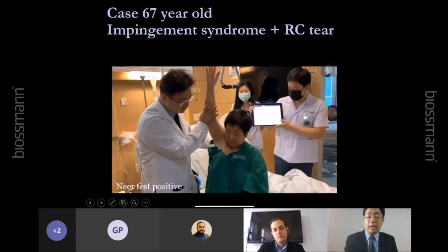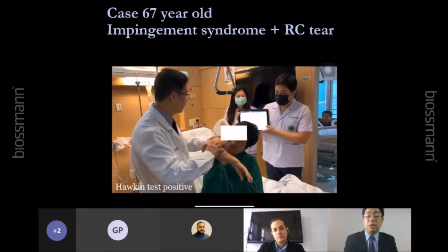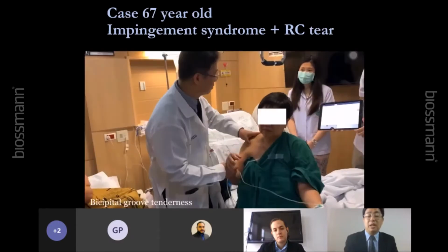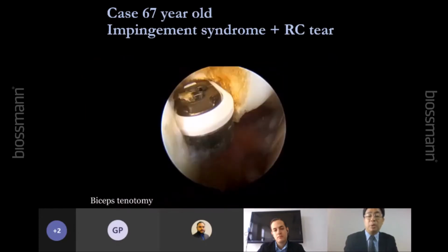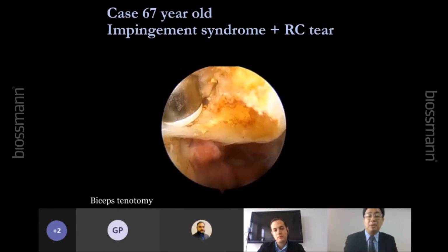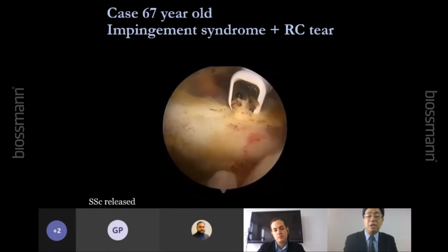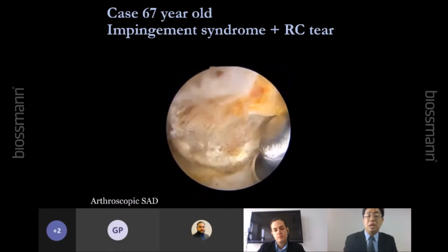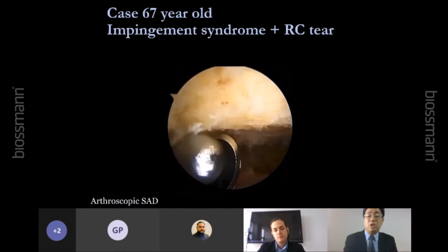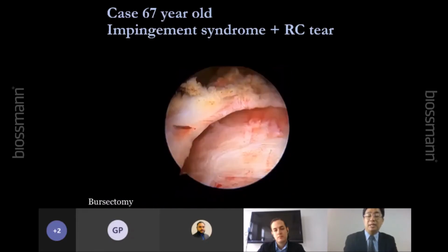So I'll show you one example. This patient is 67 years old, he has impingement and also a rotator cuff tear, okay? He also has an AC joint and biceps problem, right? So when I get in, I cut the biceps, okay? And after that, we do the decompression, okay? This is a spur. We do the subacromial decompression. And also we do the AC joint resection. This is the AC joint, right? This is after the AC joint resection.